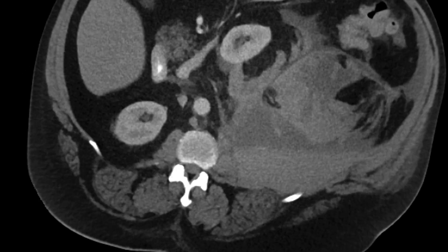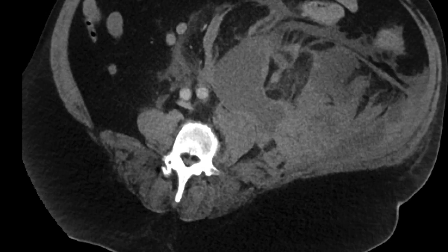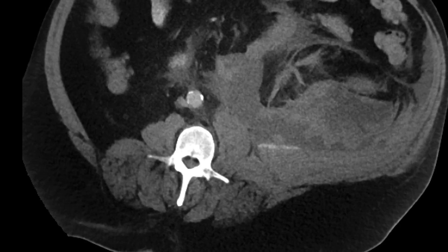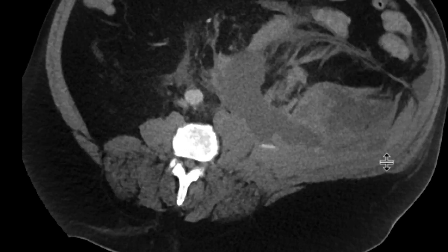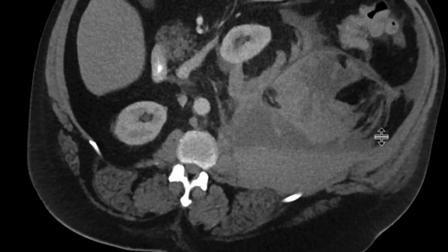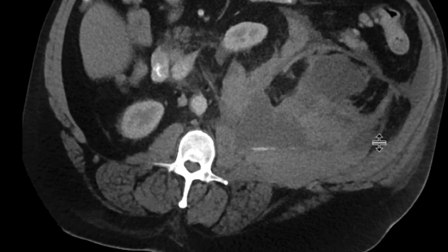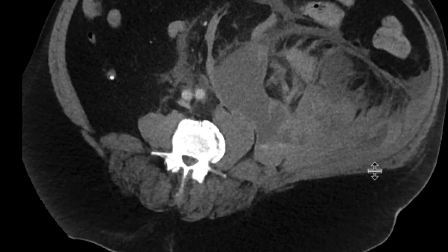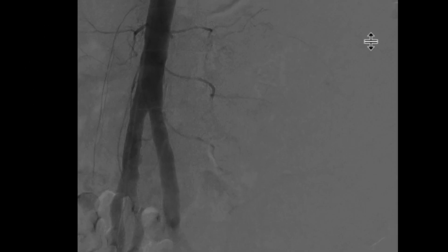And within this hematoma, we can see that there are layering regions of more hyperdense content. These findings are concerning for active extravasation of contrast. Our interventional radiology colleagues were called in to see if they could embolize something in this patient.